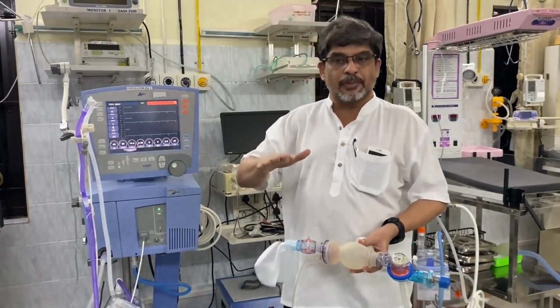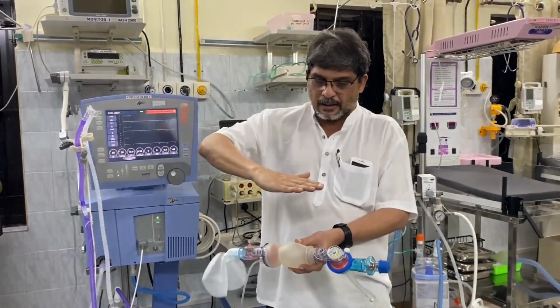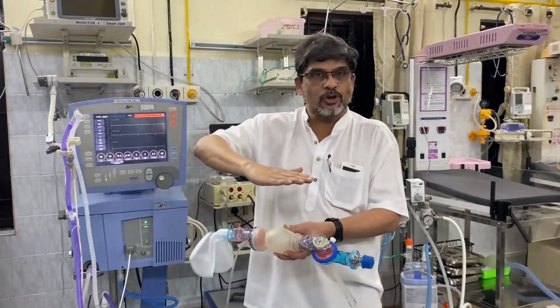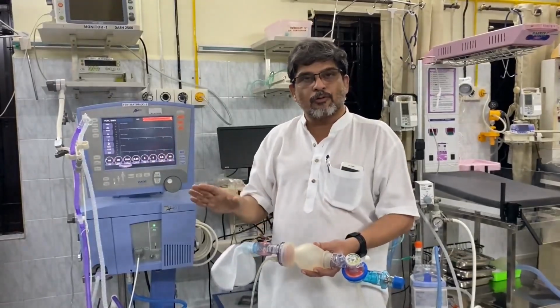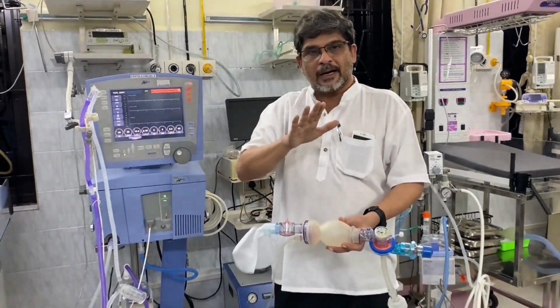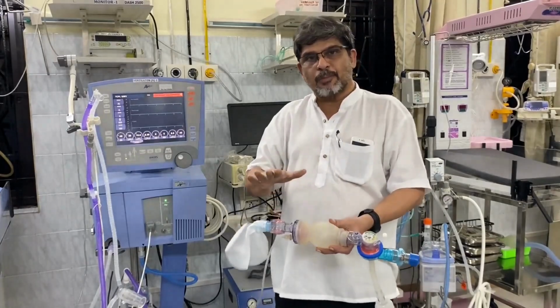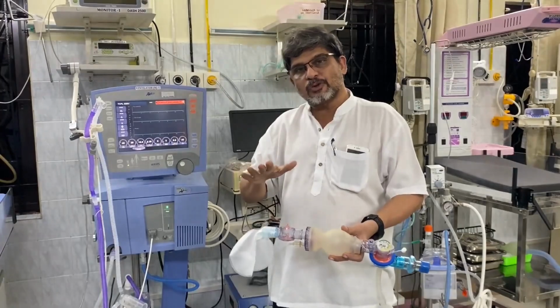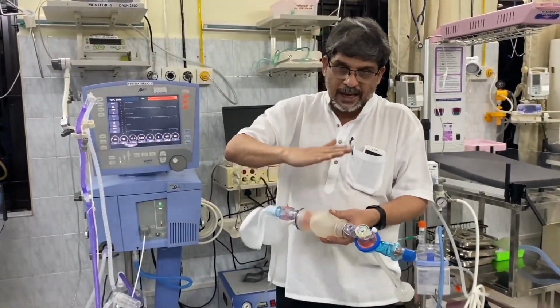So keep a look at the chest of the patient. Inspiration, expiration. You are doing a good job. Look for the color of the patient. Look for the pulses of the patient. Look for the blood pressure of the patient. If saturation is normal, tachycardia has come down, the color has come back, capillary refill time has come back, blood pressure has returned to normal, and the patient's urine output is good, that means you are doing good ventilation. Most important thing is don't allow the breath to stack.